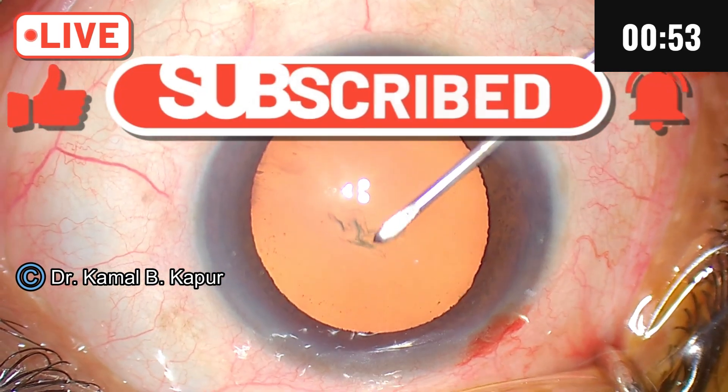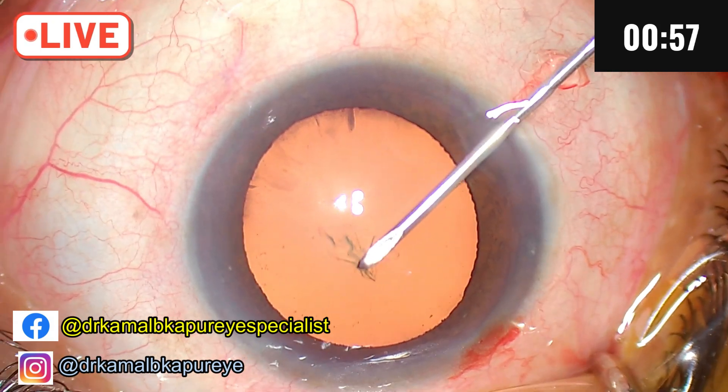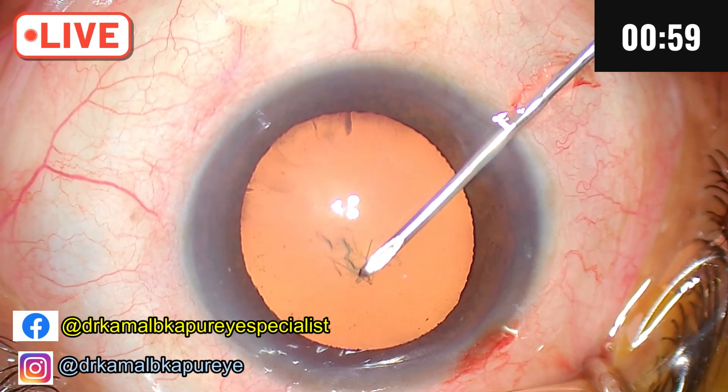Number two, due to increase of intraocular pressure, there can be a tendency for the rhexis to run out in these patients.